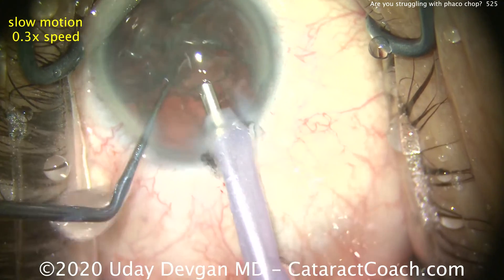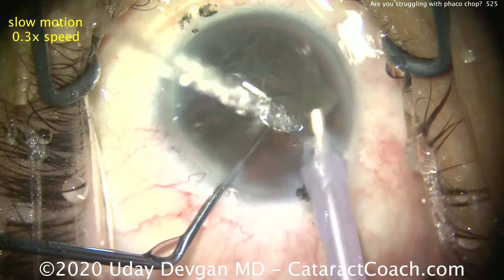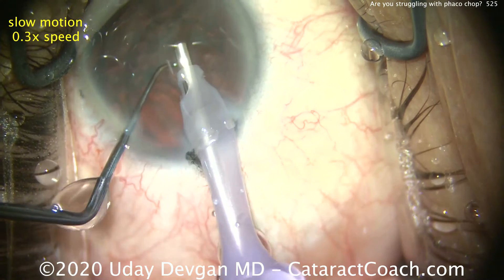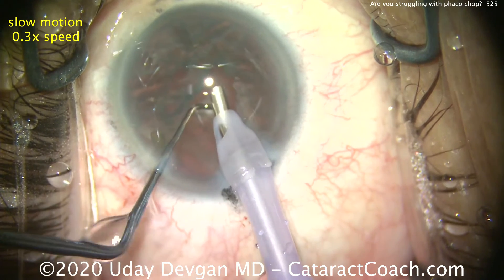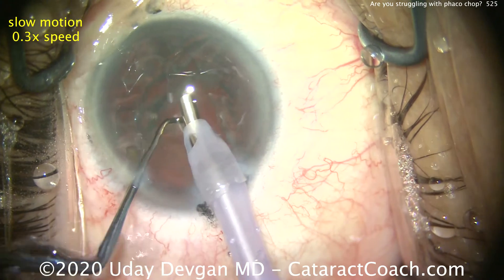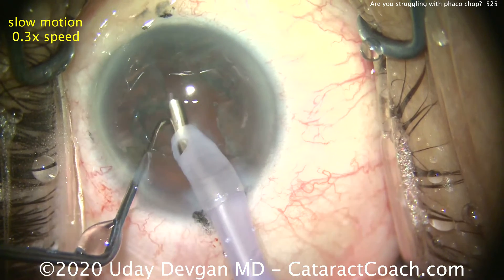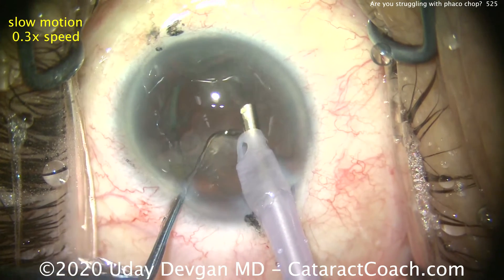We'll take out the rest of it. Here are a couple little fragments that are left, a little bit of an epinuclear shell. The epinuclear shell we're just simply going to vacuum — very minimal energy at all. We don't use a separate epinuclear setting here. We can just use our same settings, vacuum only. Grab the piece, pull it centrally, and grab it, pulling it centrally.